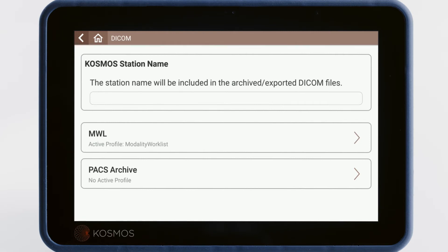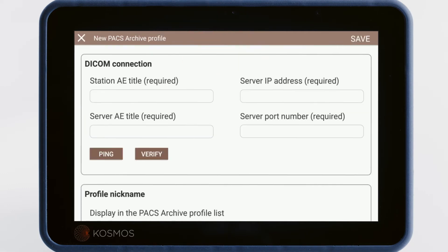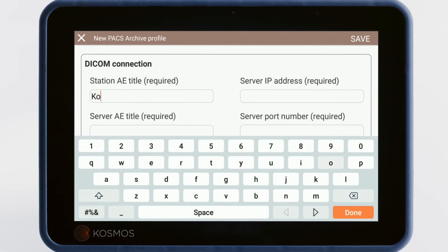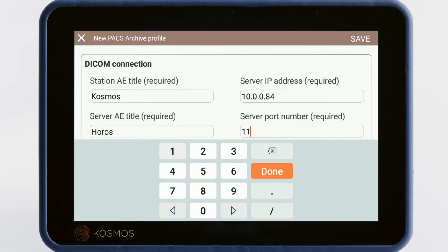To connect to PACS, tap on the PACS Archive button. In the PACS Archive screen, you'll see any active profiles. To add a new profile, tap the plus sign. This will bring you to a form where you can add the Cosmos AE title, IP address, the PACS AE title, and the PACS port number.